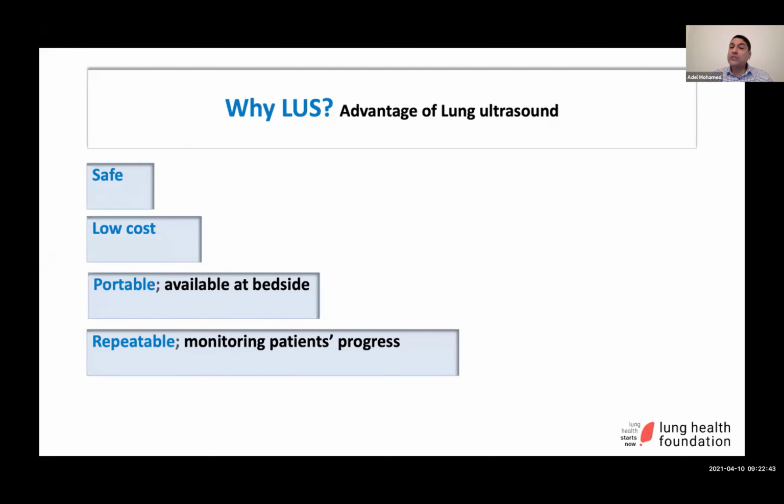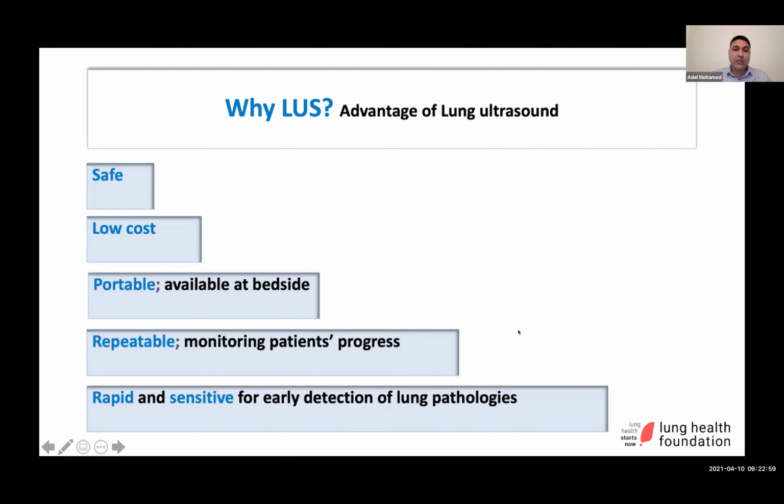You can do continuous monitoring of your patient by yourself. So you are the physician who's taking care of the patient, you know the clinical background, you see what's going on in the lung, you do your therapy, you go back and recheck. So there is continuity of monitoring using lung ultrasound.